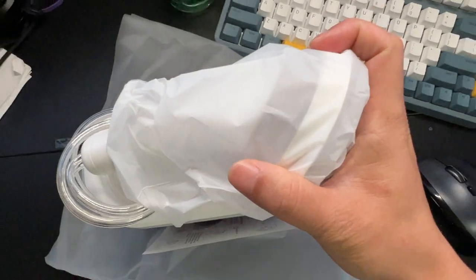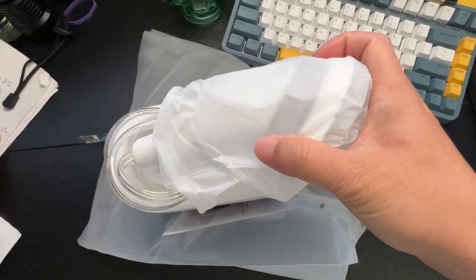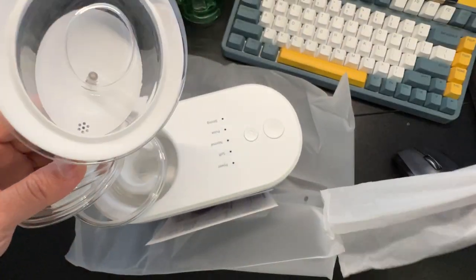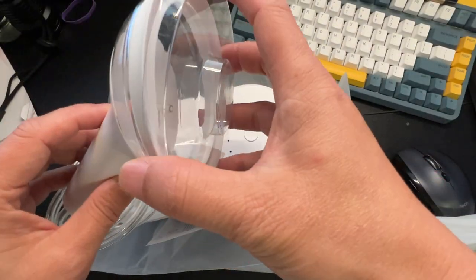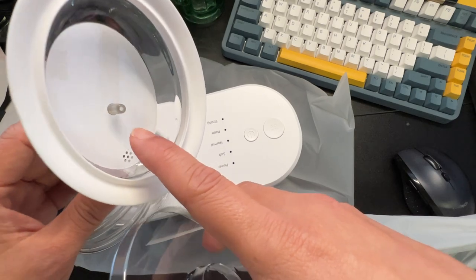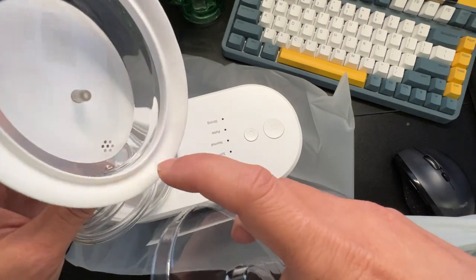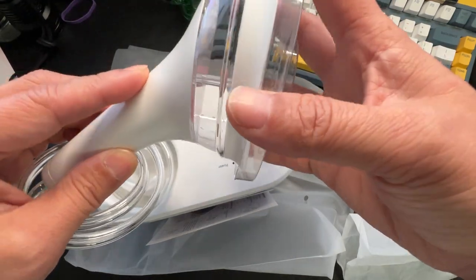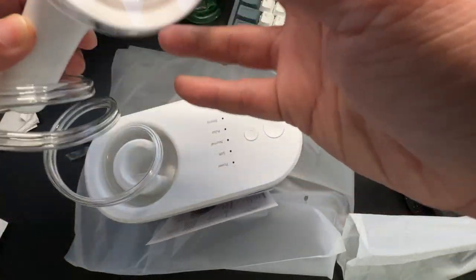Let me zoom out a little bit so you can see better. Here's the little ear cleaning tool — it squirts water into your ear and drains down into the tube. I'm not too sure about that part yet, but we'll take a look and find out.